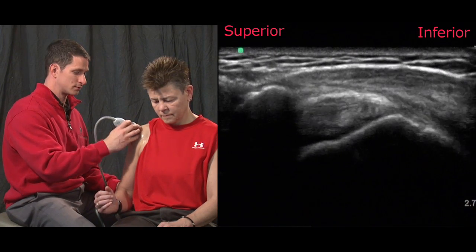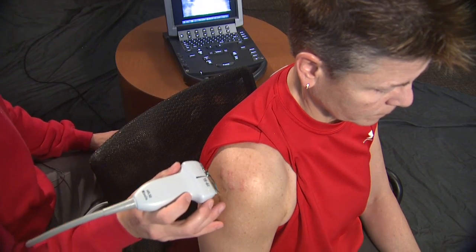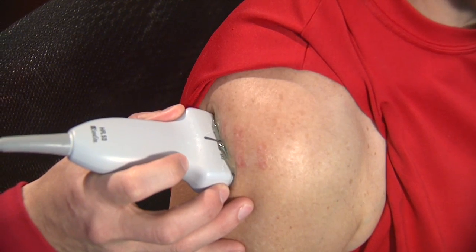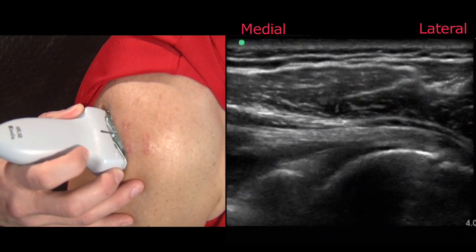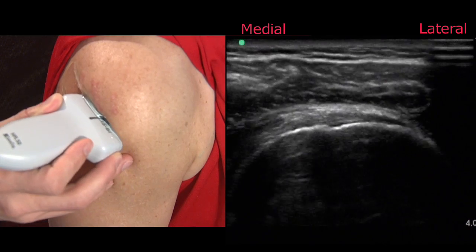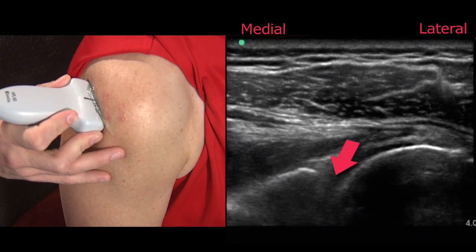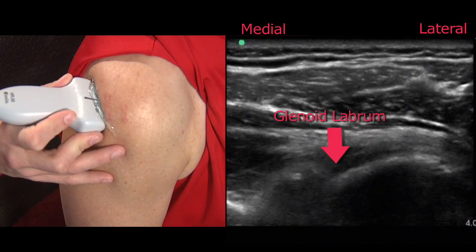Next we'll move to the posterior shoulder to examine the infraspinatus and the posterior shoulder joint. The assessment of the infraspinatus is performed by placing the transducer right at the posterior joint margin directly beneath or inferior to the scapular spine. From this position we can see the infraspinatus tendon in long axis and follow it around to its attachment on the greater tuberosity. From this position you can also appreciate the posterior joint margin and the humeral head as it articulates on the glenoid with the interposed glenoid labrum.